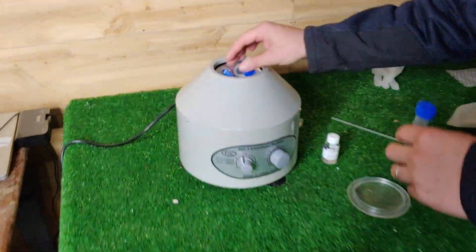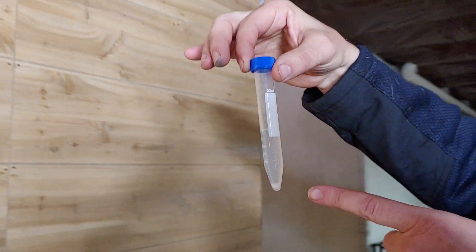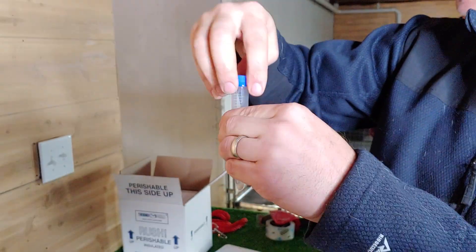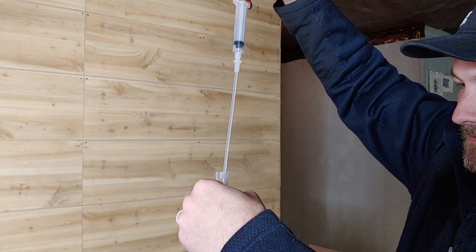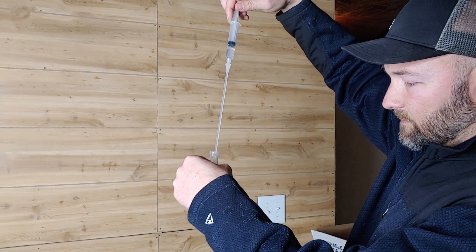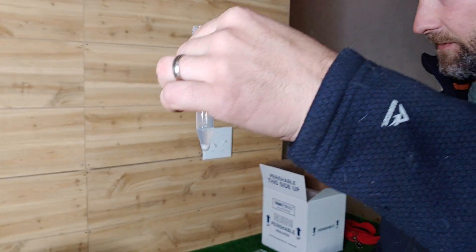Our centrifuge has stopped. When you pull it out — boom — you can see that rich semen. That's a sperm-rich pellet right there. That's what you want — that's the real deal. So we're going to take the excess seminal fluid out, go down to about a milliliter, and remove that excess fluid. We're down to just that sperm-rich pellet. That's what we want.